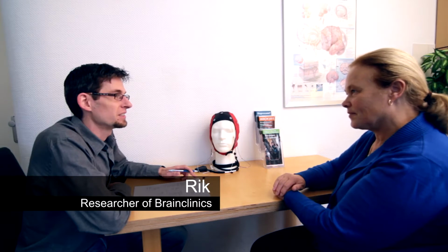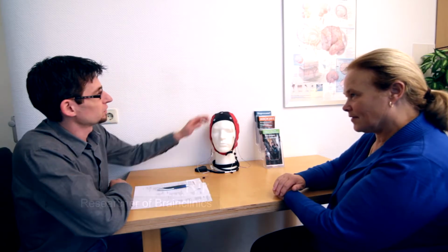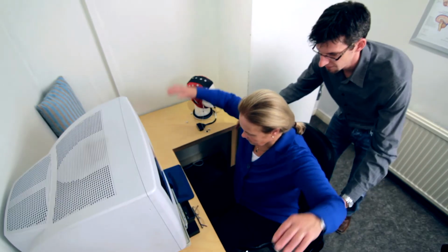First, a brief conversation takes place between the researcher and the client. During this conversation, the researcher will explain the procedures of the QEEG assessment. The client is then asked to complete a number of forms. After the conversation, the researcher and client proceed to the room where the assessment takes place.